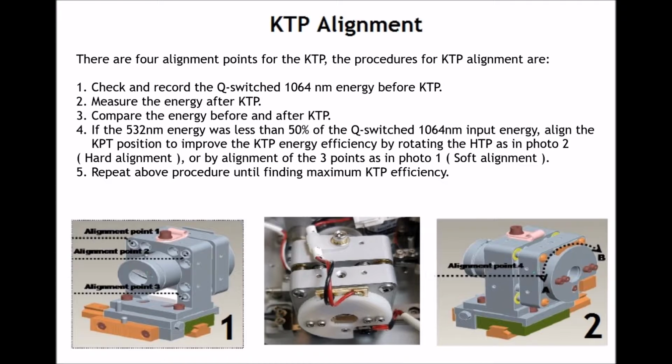The procedures for KTP alignments are: 1. Check and record Q switch at 1064 nanometer energy before KTP. 2. Measure the energy after KTP. 3. Compare input energy before and after KTP. 4. If the 532 nanometer energy is less than 50% of the Q switched 1064 nanometer input energy, align the KTP position to improve the KTP efficiency by rotating the KTP as in photo 2, hard alignment, or by alignment of the 3 points as in photo 1, soft alignment. 5. Repeat the above procedure until finding maximum KTP efficiency.